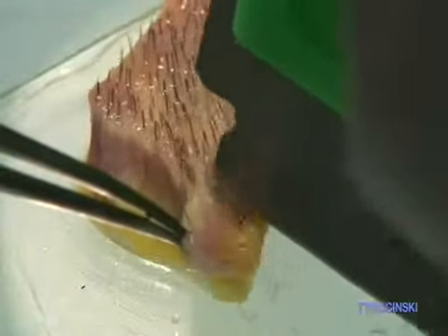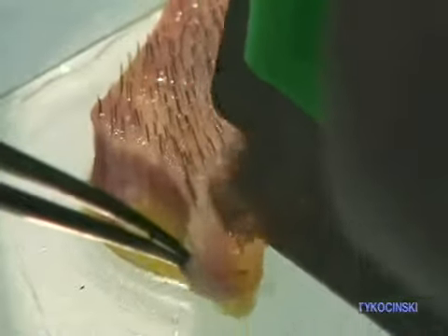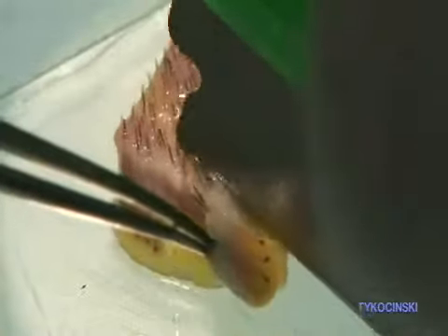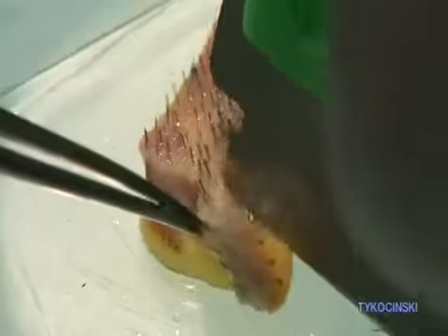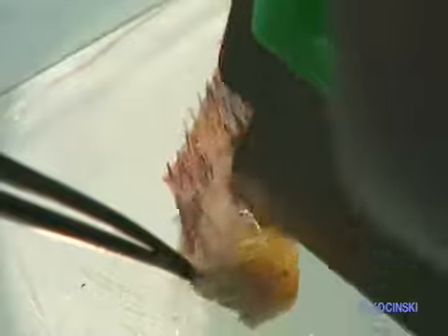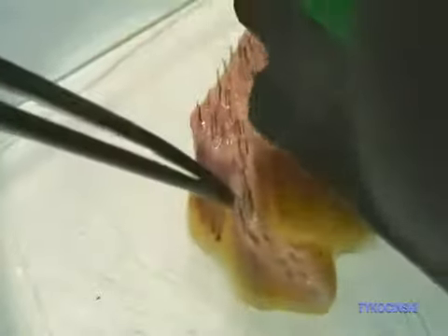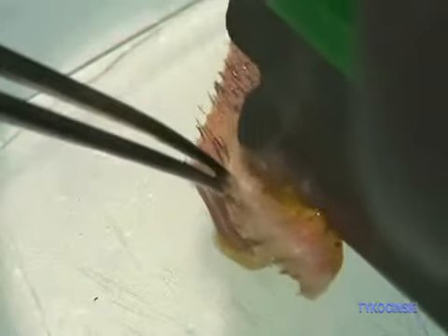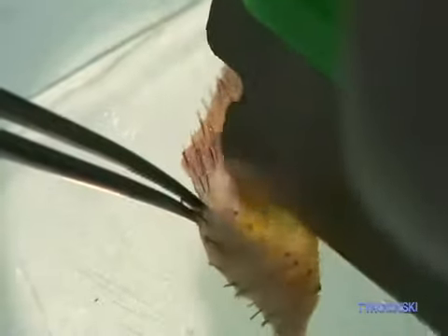Keep the follicular units intact. So when you are doing slivering, you have to search for the intact follicular units, keep them together, and follow the lines in between. That way, the slivering technique is going to be much easier and less risky to damage the follicular units. You're going to have better graft survival and more density at the recipient site.